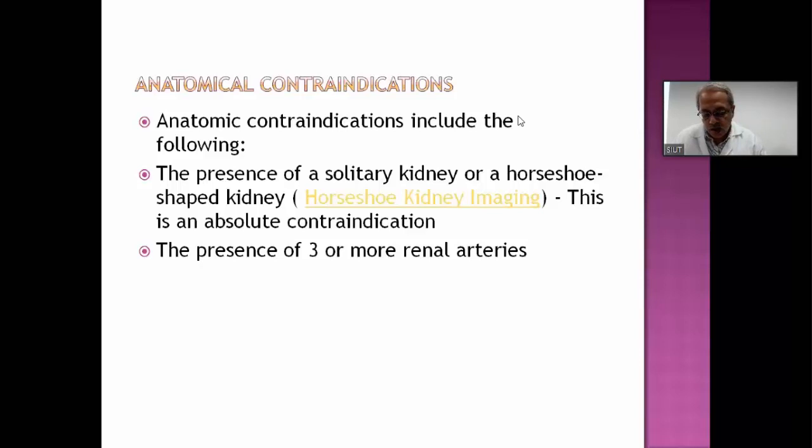Because when I take this specimen to the bench and I clear certain unwanted tissues, for instance, fat around the vessels, I may dissect a little bit into the renal hilum so that I make the vessel slightly longer in length, so that anastomosis in the recipient is not only possible, but also easier for the surgeon who is on the recipient side to do it.